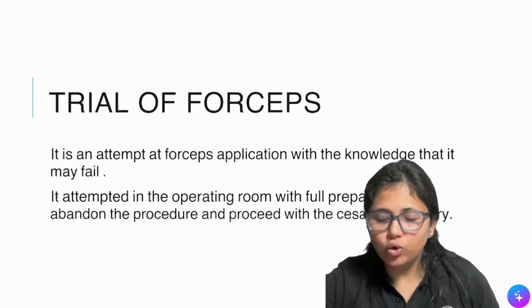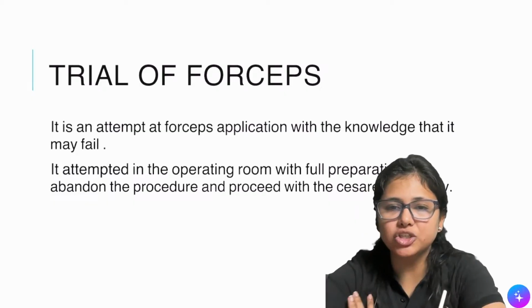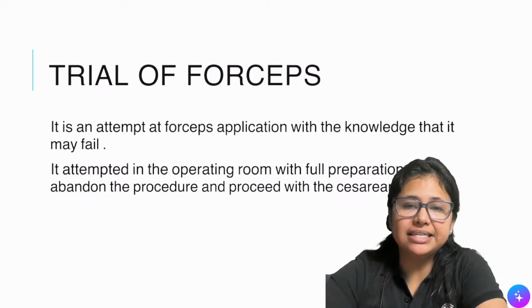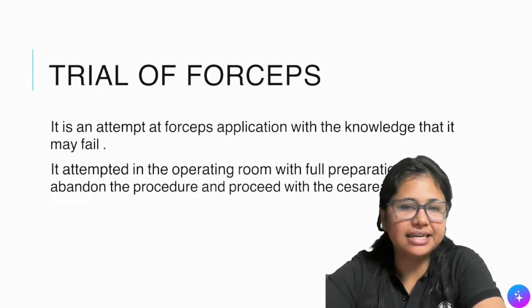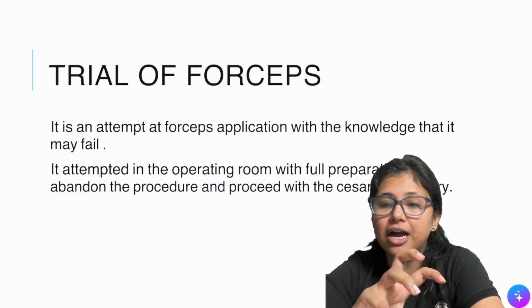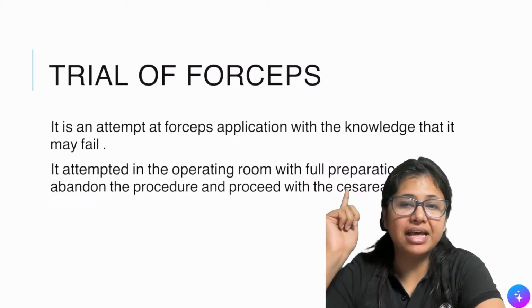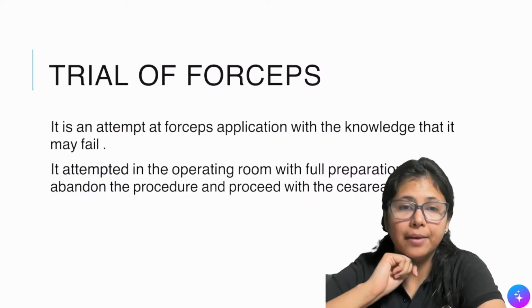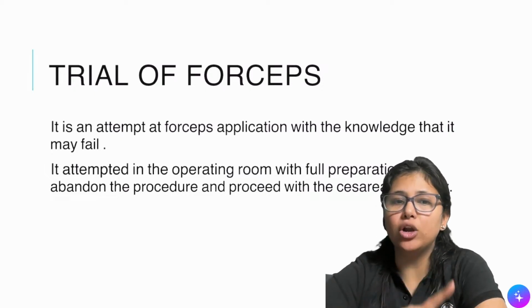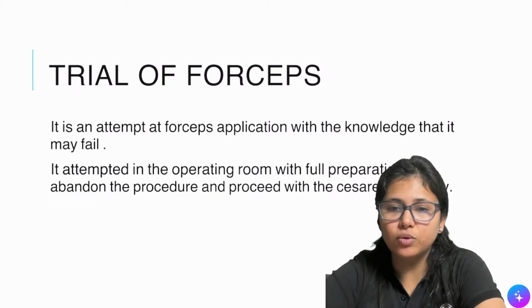Now, coming to the last two topics, which is trial of forceps. Trial of forceps का मतलब क्या है कि I am sitting in a place where I have facilities for a cesarean section, but I do feel like कि मैं instrument लगाऊंगी तो हो सकता है कि वो जल्दी बाहर निकल जाए. But in my head, I somewhere have this that this might fail, right? So this is an attempt at forceps application with the knowledge that it may fail.